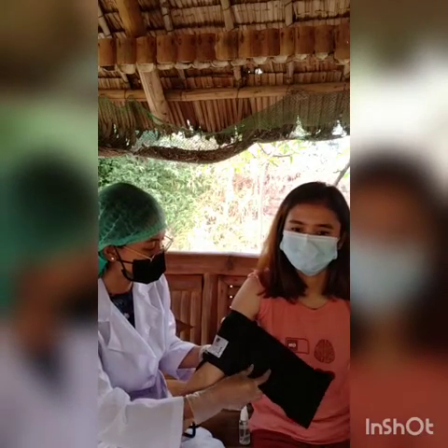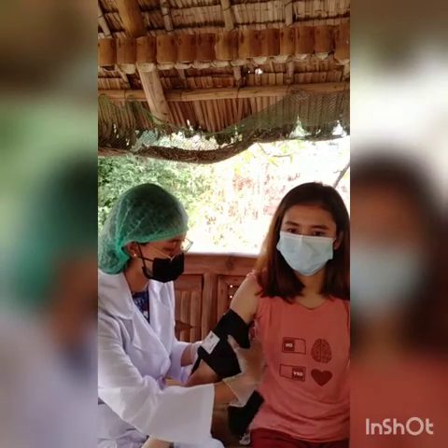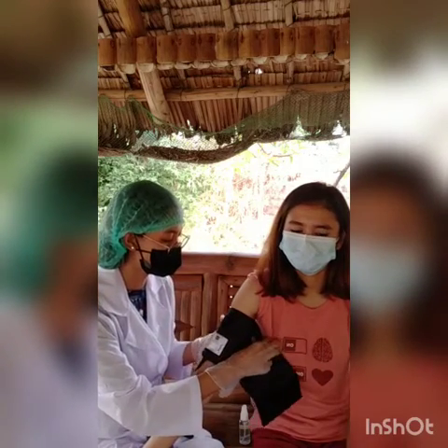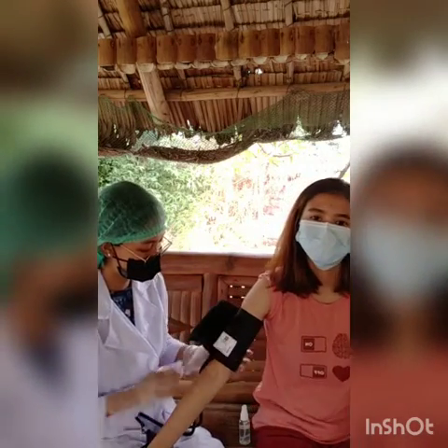Dapat hindi masyadong mahigpit. Dapat normal ay sakto lang yung pagkakaporma sa kanya.